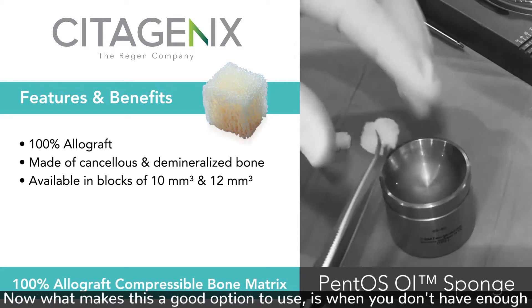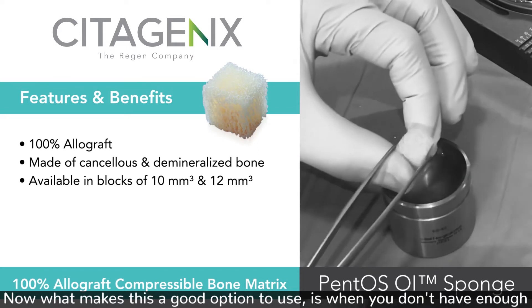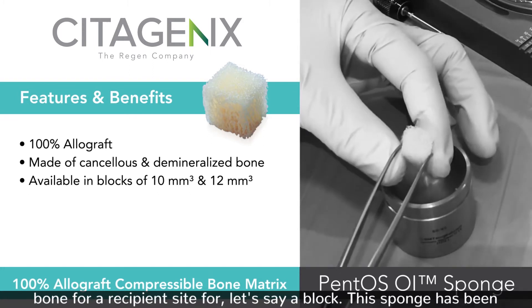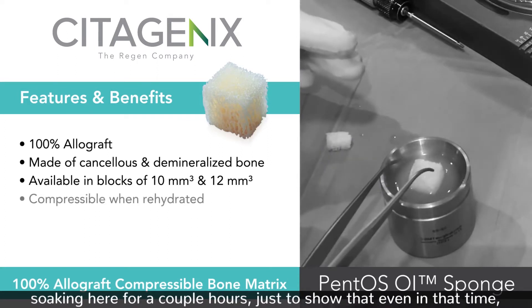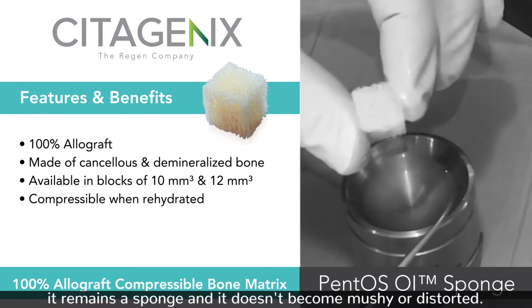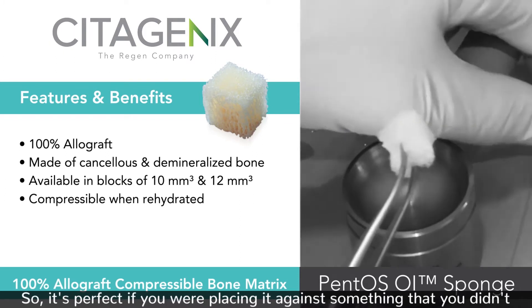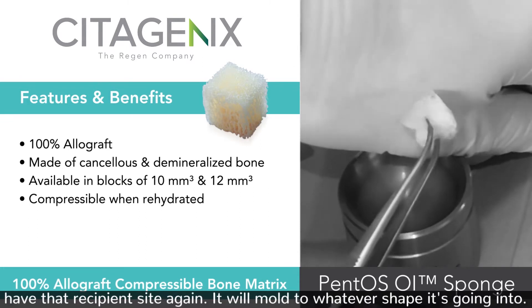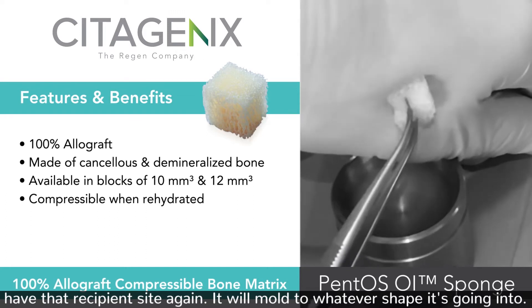What makes this a good option to use is when you don't have enough bone for a recipient site or a block. This sponge has been soaking here for a couple of hours just to show that even in that time it remains a sponge and doesn't become mushy or distorted. It's perfect if you were placing it against something where you didn't have that recipient site, and it will mold to whatever shape it's going into.